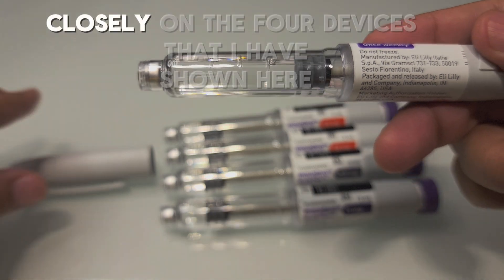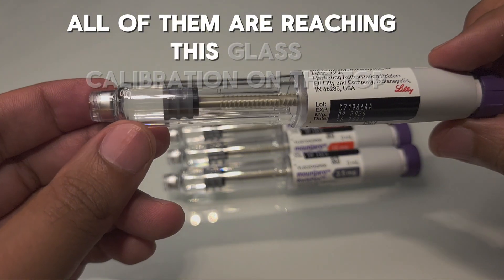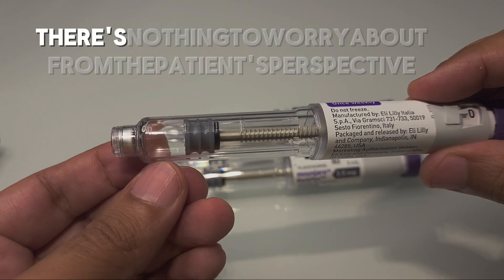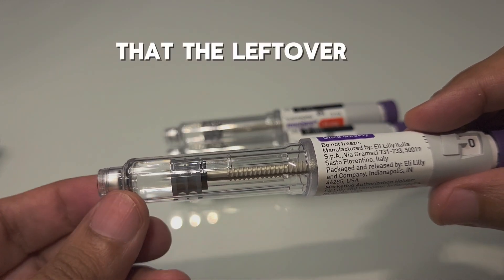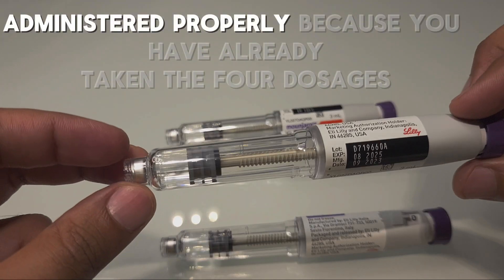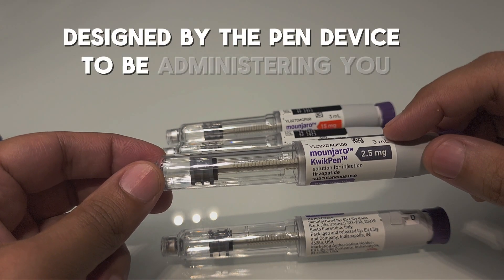Looking closely at the four devices I have shown here, all of them are reaching this glass calibration at the top, suggesting that the four doses have already been consumed. There is nothing to worry about from the patient's perspective — the leftover fluid is not any leftover drug that has not been administered properly.